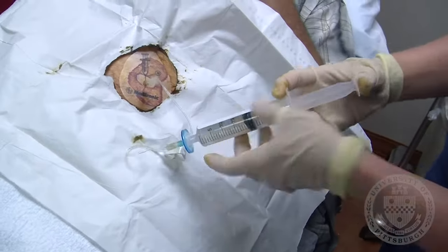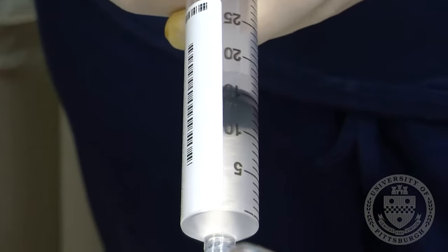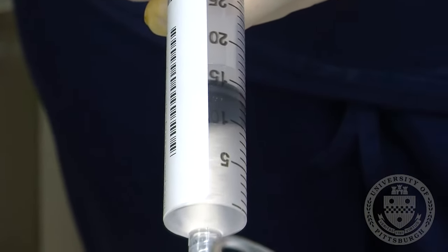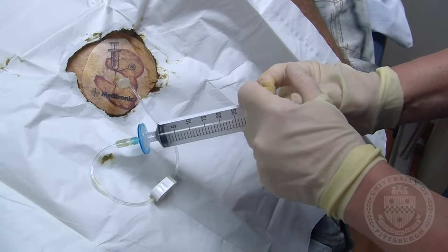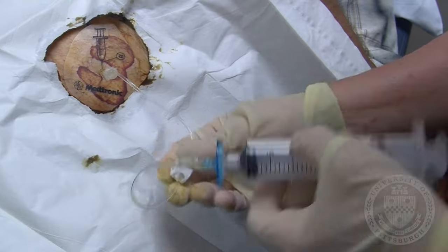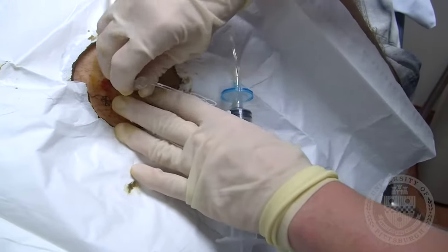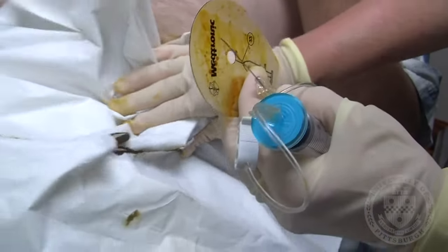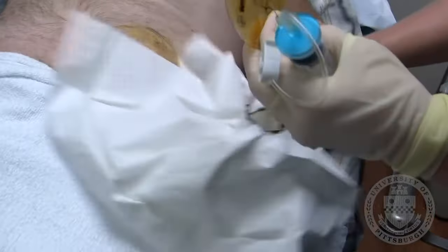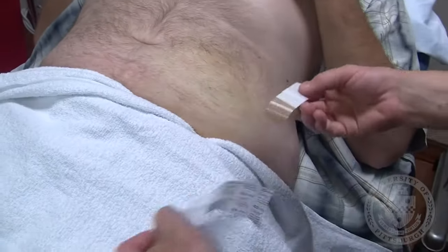The new syringe of medicine is attached to the catheter and the medicine is slowly injected into the pump through the blue disc, which is a filtration system. Once complete, the needle and catheter are removed. The Betadyne is wiped from your skin and a bandaid is applied.